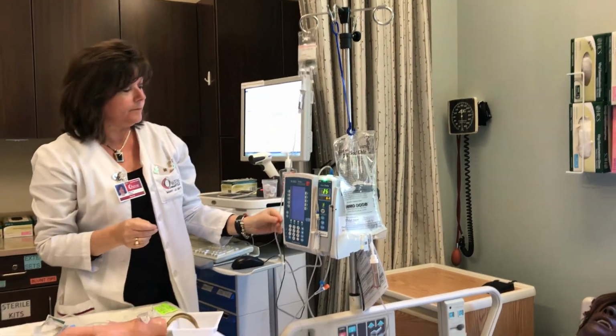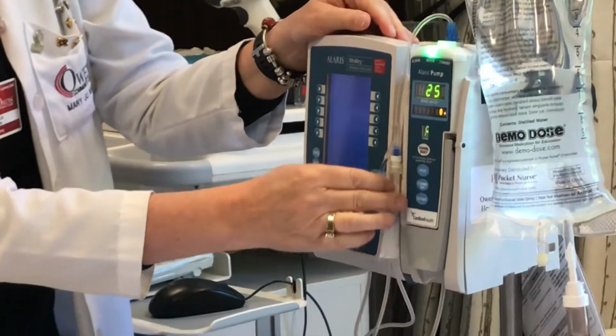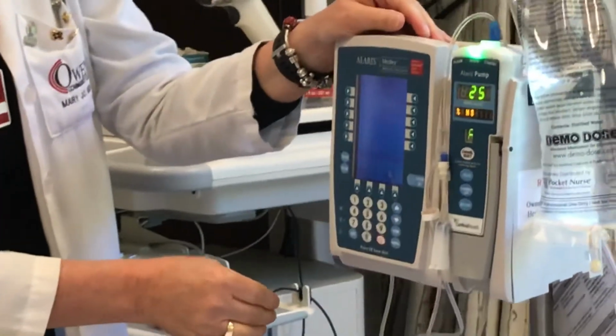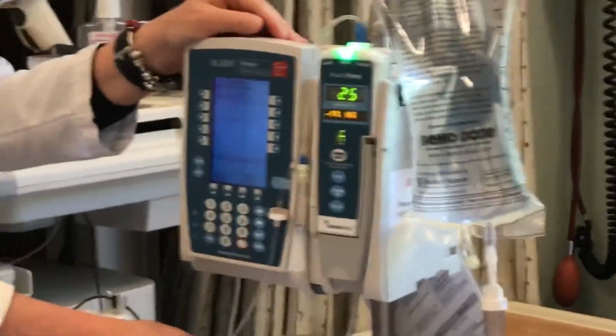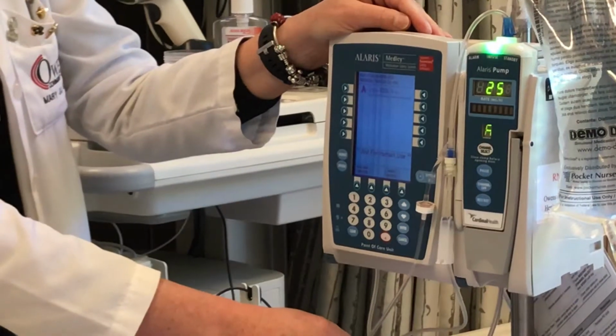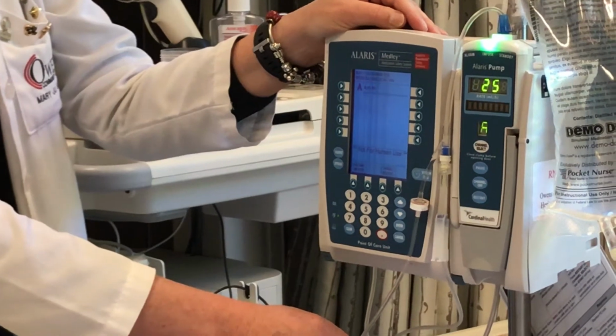Program IV pump for secondary rate and volume to be infused, VTBI. Verify rate with your calculation. Open roller clamp on IV piggyback tubing and start infusion. Observe infusion flow. Observe IV site and patient for any adverse reactions or infiltration.